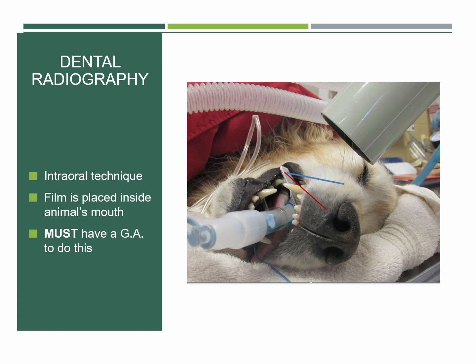This is where you're going to be frustrated with dental radiography. Every set of teeth has a different technique because we need to get that root, and because of the palate and the shape of the teeth, you're going to have a bunch of different techniques in order to get a good view that's not elongated or foreshortened. So the film is actually placed inside the patient's mouth.